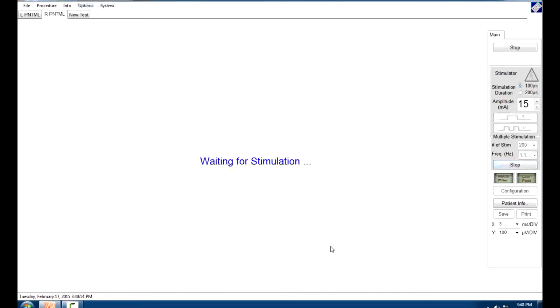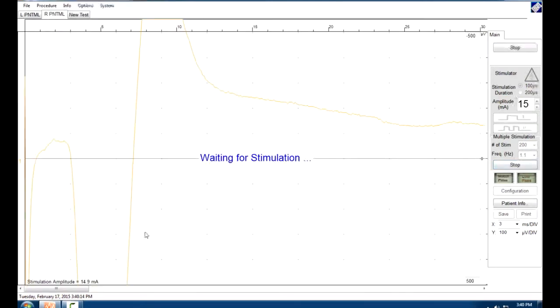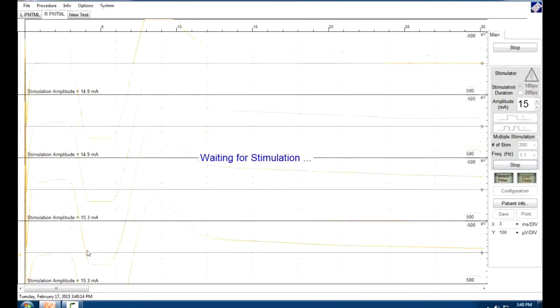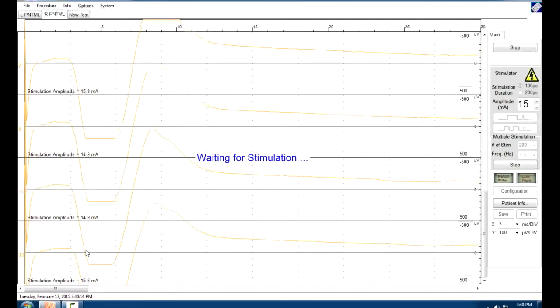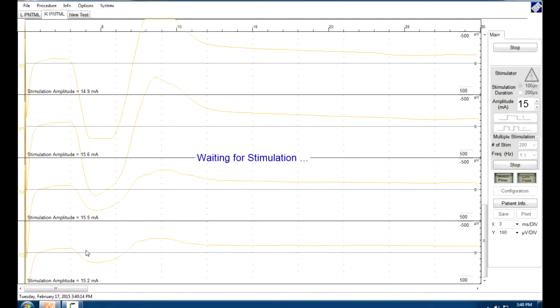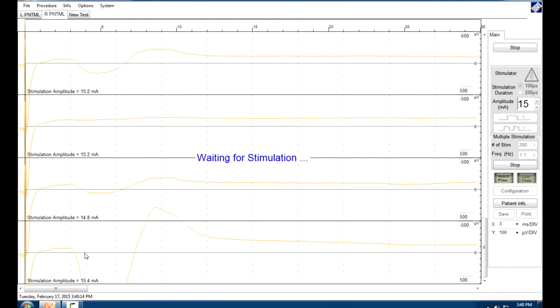And here we go. We're going to have our different stimulations. You can see they stack on top of each other. And we're going to move back and forth until we get right on that nerve. You can see we've got some pretty robust stimulations this time. See, we're getting multiple ones just exactly the same again. You can see how it stayed there. So we're going to stop the stimulation here.